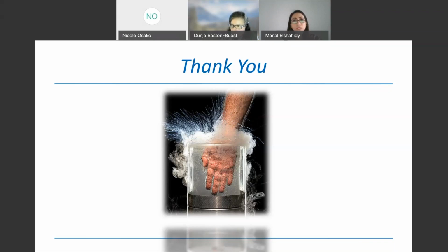It might give some details about the transported embryos, right? Yeah, I believe. You would also need to enclose with the documents the followed protocol for vitrification, because the center receiving these embryos might use different media or a different device. Yes, that's true. So that's just the way we do it: we include the device and the kit we used for the vitrification.